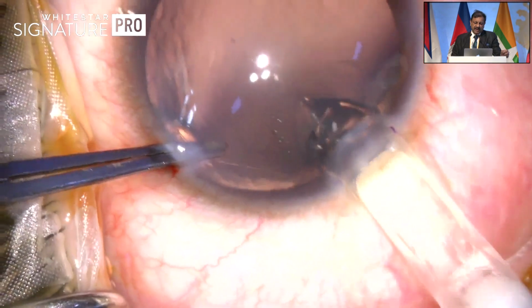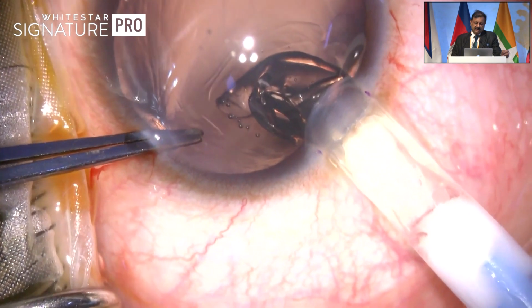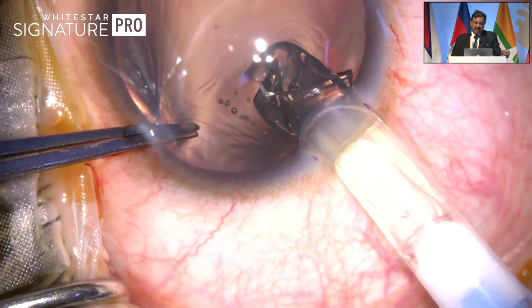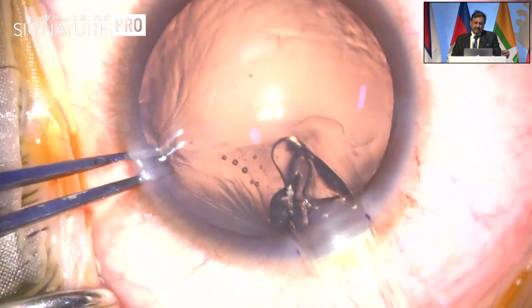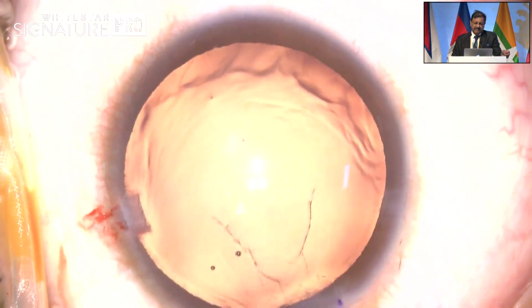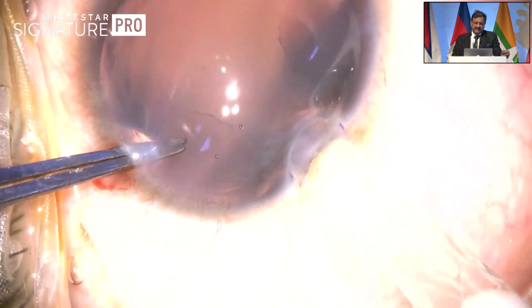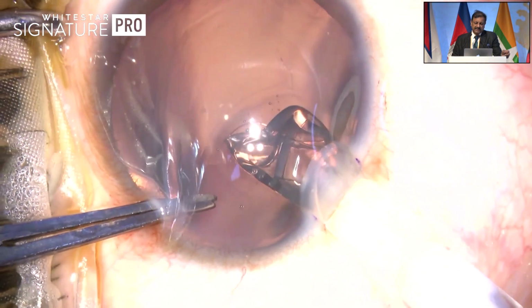Just watch again. The lens leading haptic has been caught, and there is no point in pushing the lens. It's better to withdraw and see the lens is caught, because it's very, very delicate. The central part of the optic is just 50 microns. So you have to be very, very careful you don't tear the lens apart.